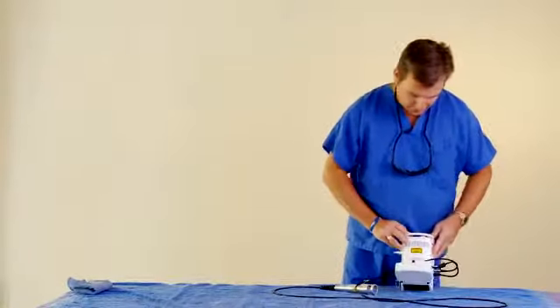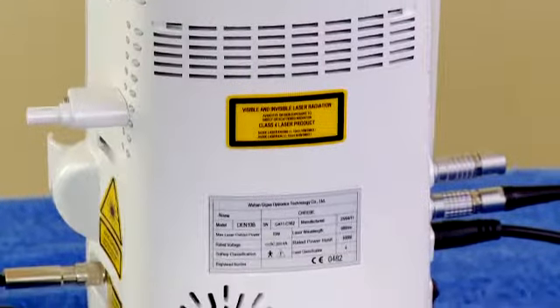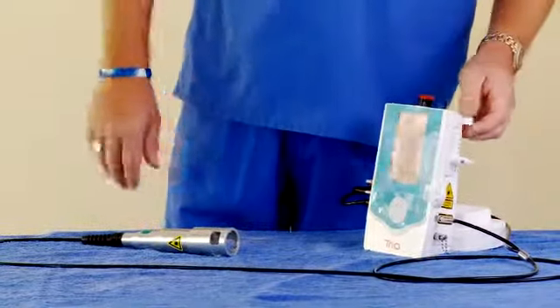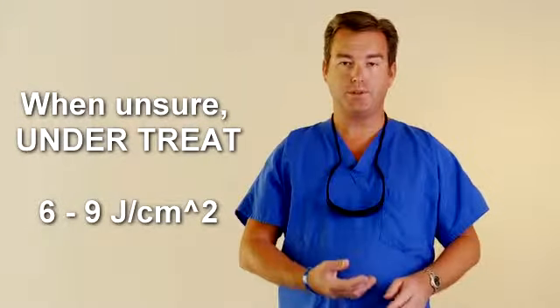And as you can see, you have cooling fans that are easy to open and can keep the diode cool for long periods of time and not overheat. That's another key feature to the laser. But keep in mind, whenever you're treating something that you're not sure of, always undertreat. 6 to 9 joules per centimeter squared is the typical range. We've seen in research, anytime you go over 10, you can have contraindications with older patients where you'll have some swollen joints, that kind of thing. Nothing too terribly bad, but you don't want to have a treatment go in the wrong direction.